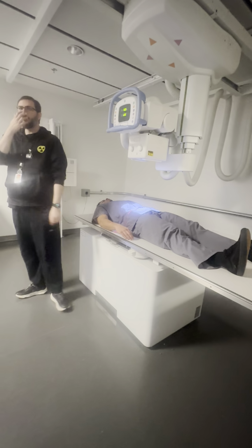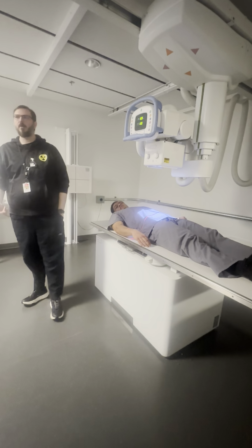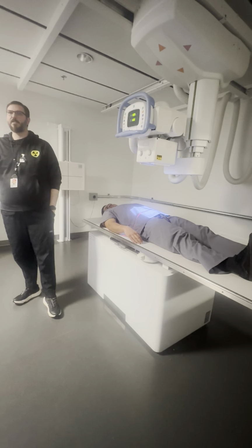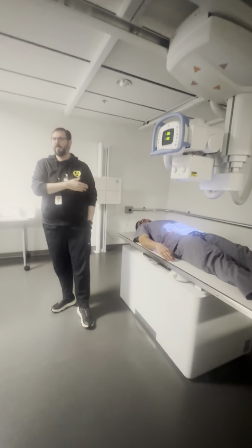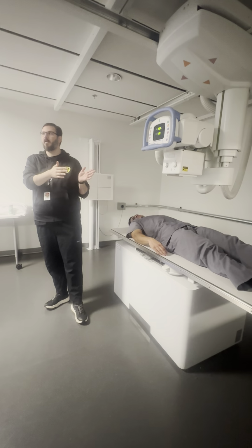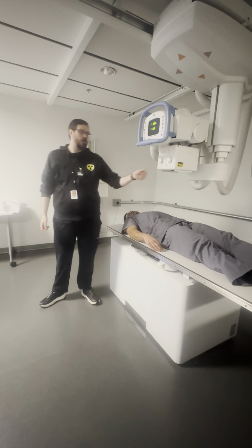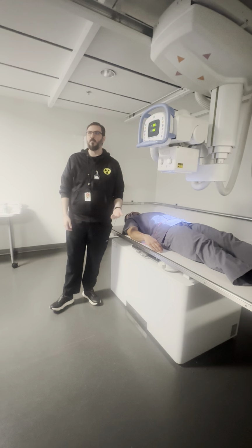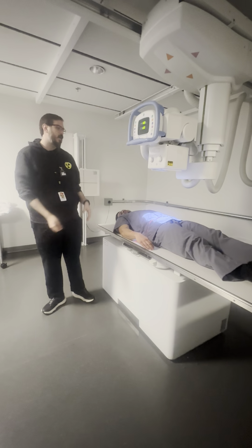So how often are you taking shots to see how it's moving? 15, 30, 45, an hour. Some of your facilities do 0, 30, 60. So if I haven't taken a shot since my initial, I stay at my initial. Then I let the shots dictate to me when I go to my delay. This can be like a 6-hour procedure. I might not go to delay until hour 3, right? It's possible.